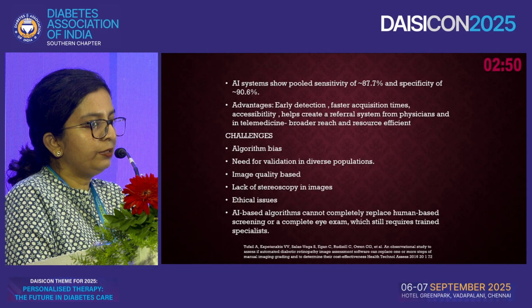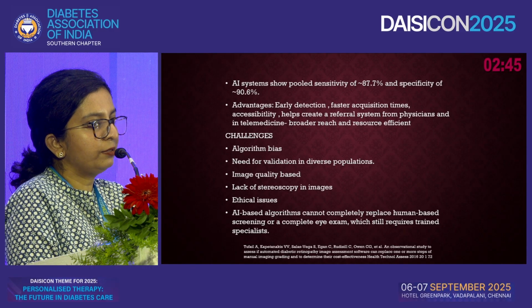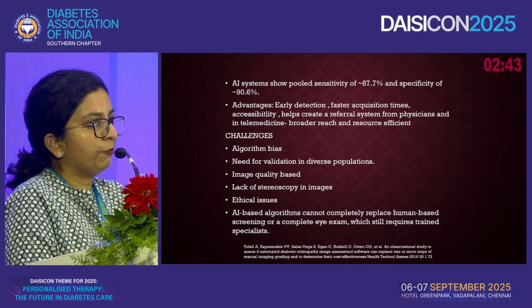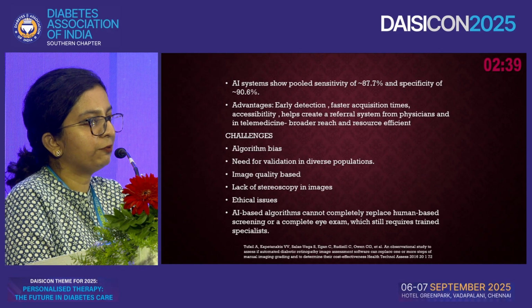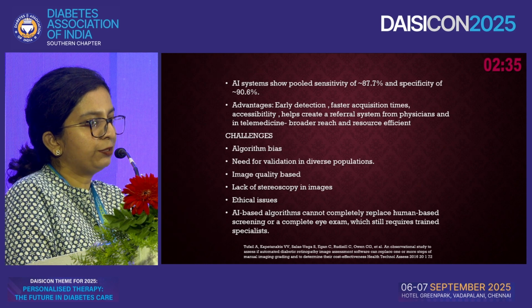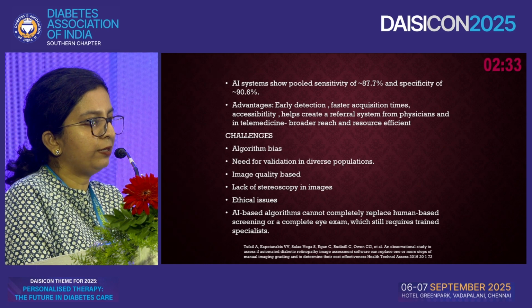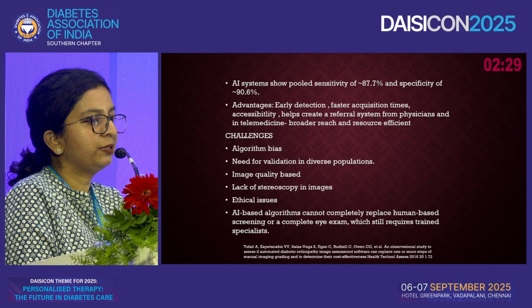So the algorithms as such help us in early detection and faster acquisition times. And of course, it enables better accessibility. So in the long run, it will be resource efficient also, when we can screen a large number of patients with AI-dependent software and fundus photography models.